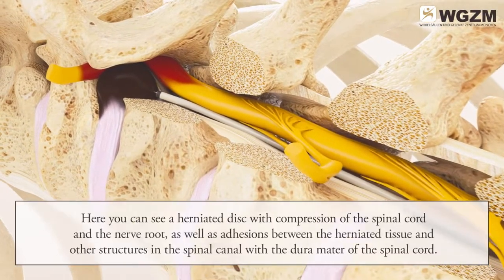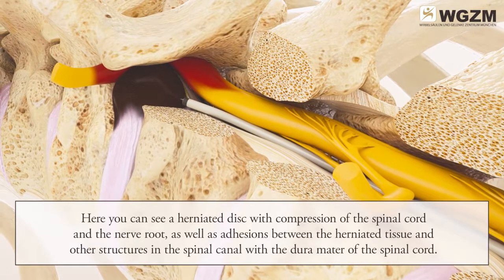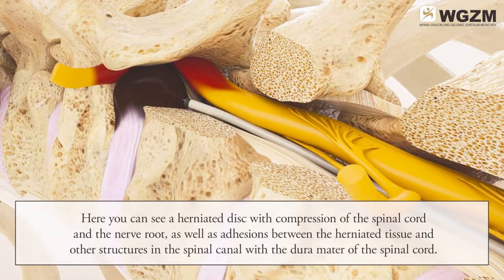Here you can see a herniated disc with compression of the spinal cord and the nerve root, as well as adhesions between the herniated tissue and other structures in the spinal canal with the dura mater of the spinal cord.